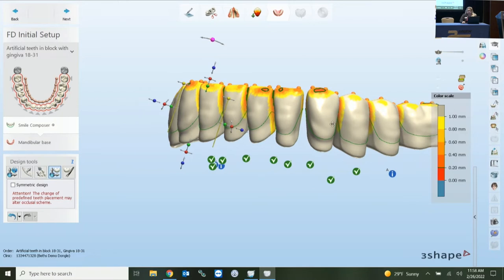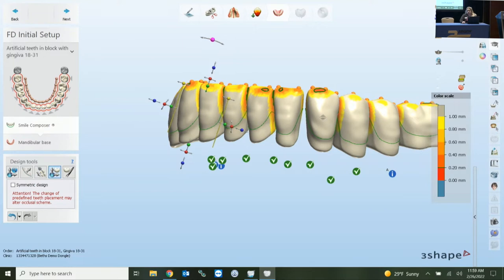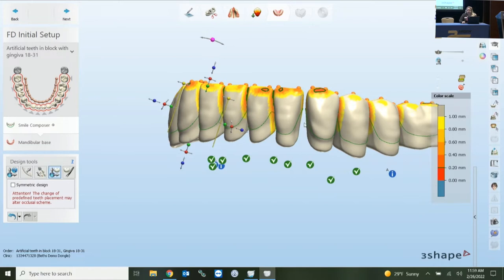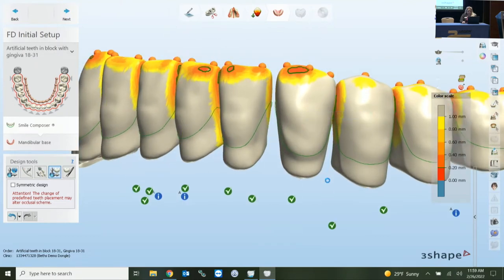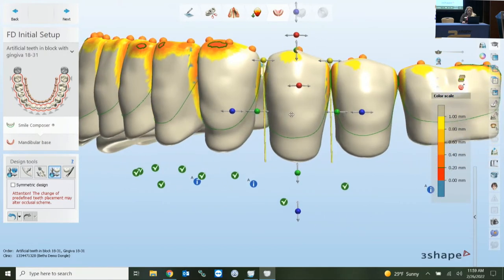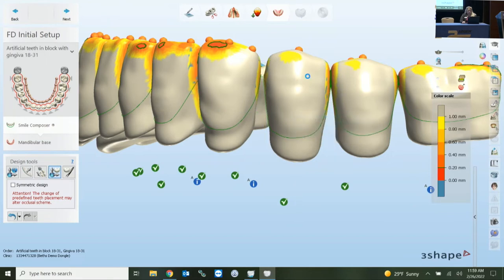Different laboratories do different things based on their manufacturing process. If you're milling, a full roundhouse takes more space, so many labs section into two sections, or two posteriors and a single anterior, or even four sections. That helps nest more bridges in your puck. 3Shape gives you the option to set this up in your order form — you're telling the system how you're outputting it. A lot of digital denture output comes directly from your order form; 99% of output issues come from there.